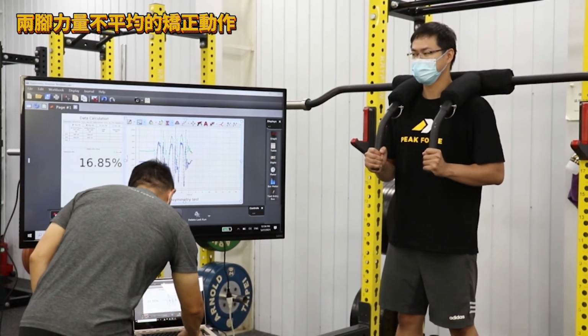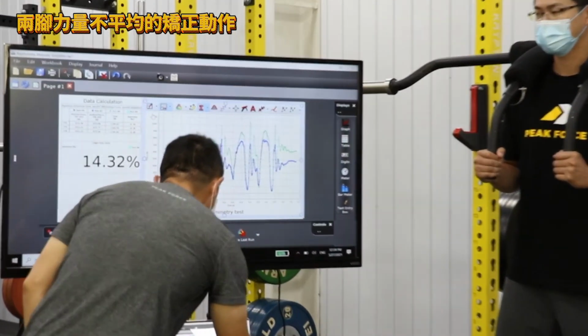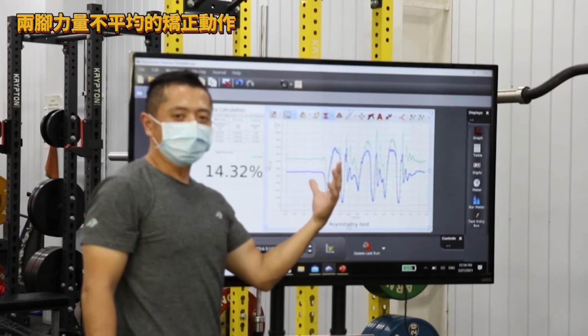Good. Okay. So here I'm gonna actually zoom in. I hope you can see this.